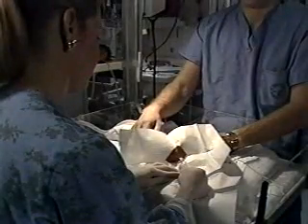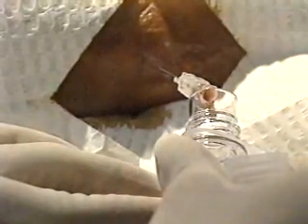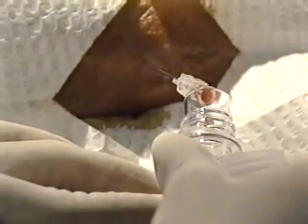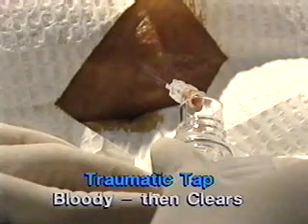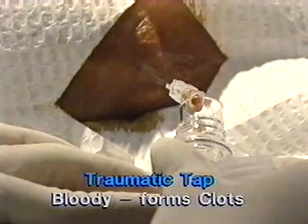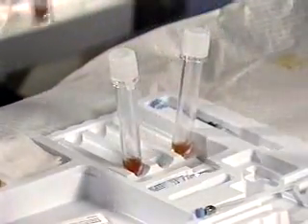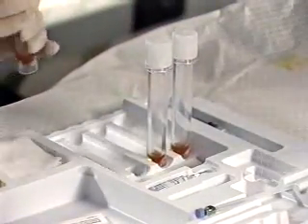If bloody fluid is obtained, the practitioner needs to determine if a vessel was hit or whether the fluid is truly bloody CSF. A traumatic tap or a tap where a blood vessel is hit is evidenced by bloody CSF that clears in the 2nd and 3rd tube, previously clear CSF that then turns bloody, or non-clearing bloody CSF that forms clots. Truly bloody CSF as a result of blood being present in the subarachnoid space prior to the procedure is suggested by bloody CSF that does not clear or clot.